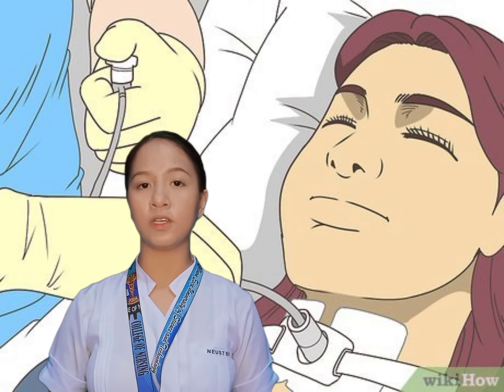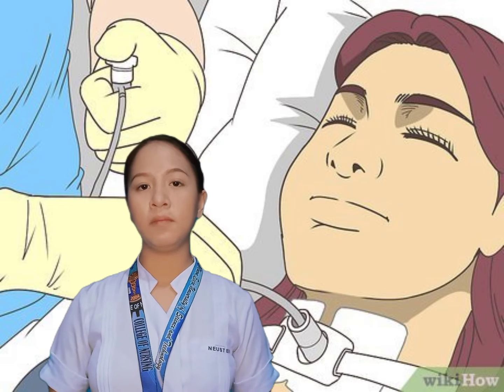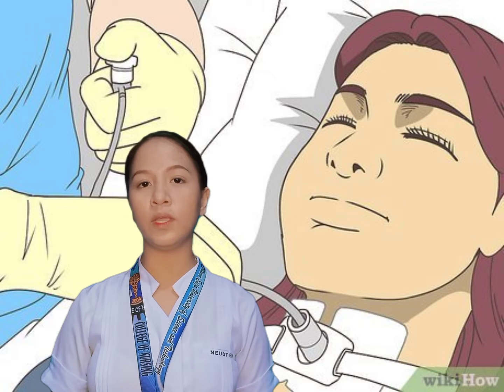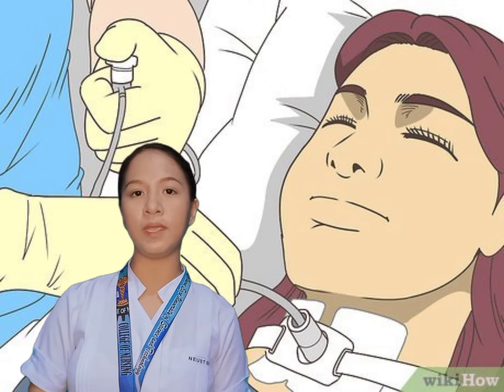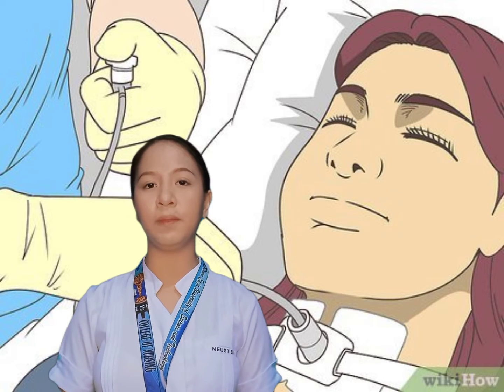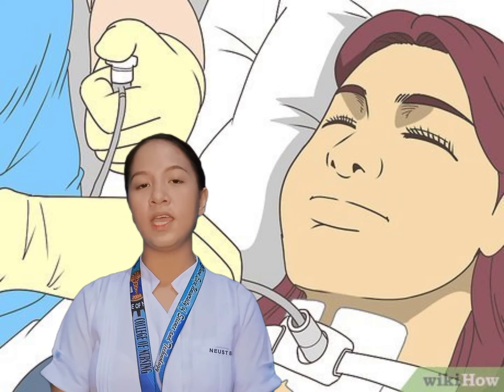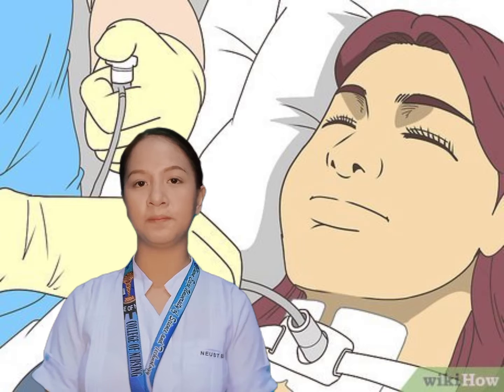used to perform suctioning. Then prepare the basins and cleaning solutions. Mix sterile water or plain NSS and H2O2 in one basin, 50-50. Be sure it will fill 0.5 inch of the basin, and add another plain NSS in another basin that will fill at least half inch. And perform gloving and cleaning the tracheostomy.